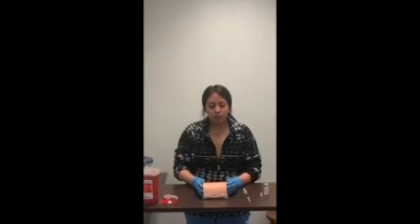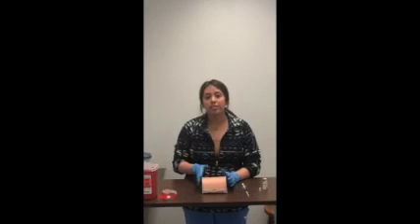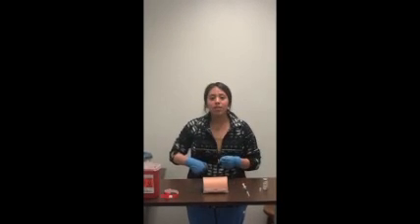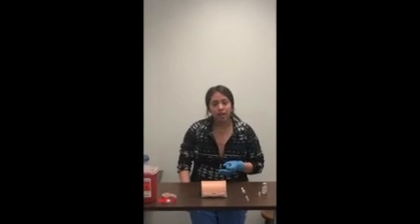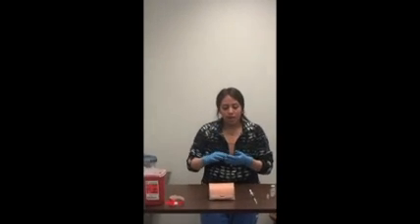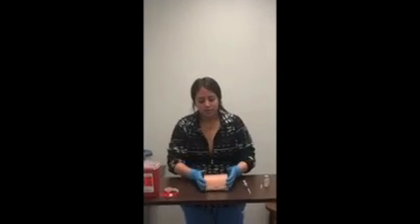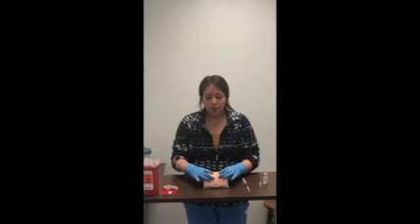I will state the five subcutaneous sites where you can give an injection: the abdomen, upper buttocks, outer thigh, upper back of the arm, and the love handle. Today I will be administering the heparin in the abdomen.